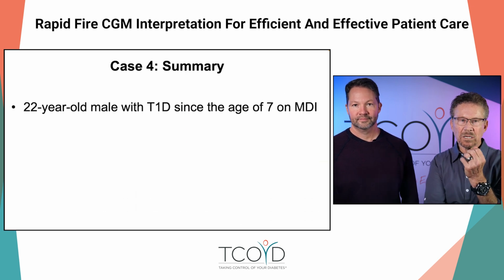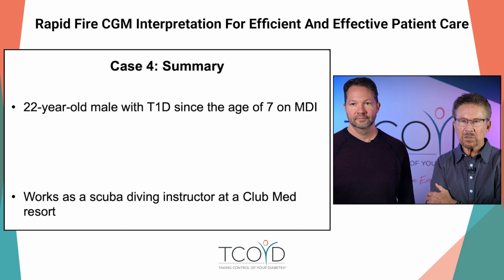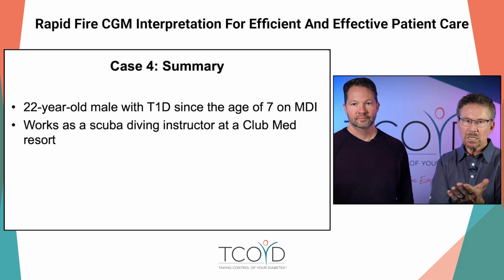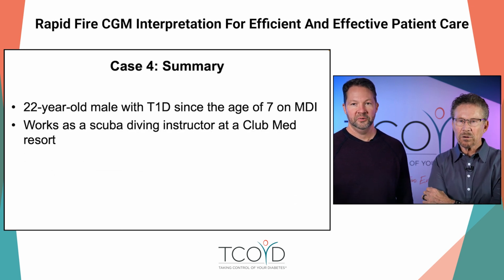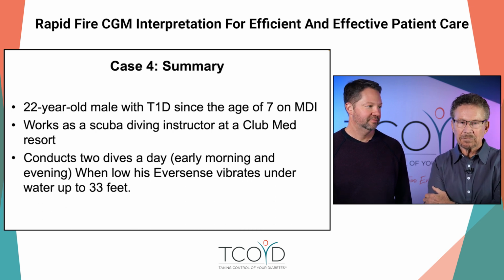He's kind of an interesting kid. He's 22 years old. He's had type 1 diabetes since the age of 7. He's on multiple daily injections. He works as a scuba diver instructor at Club Med. And he gets free tickets or something?